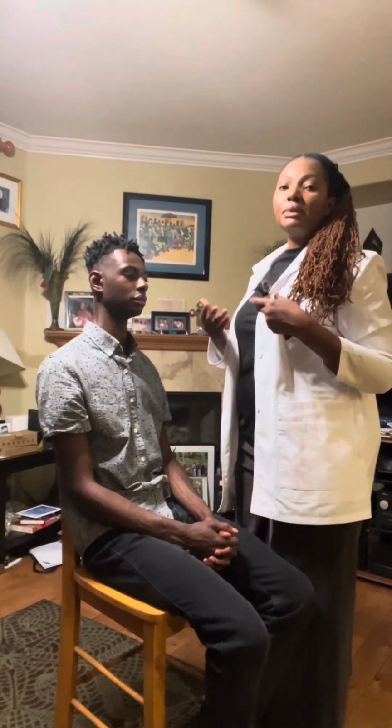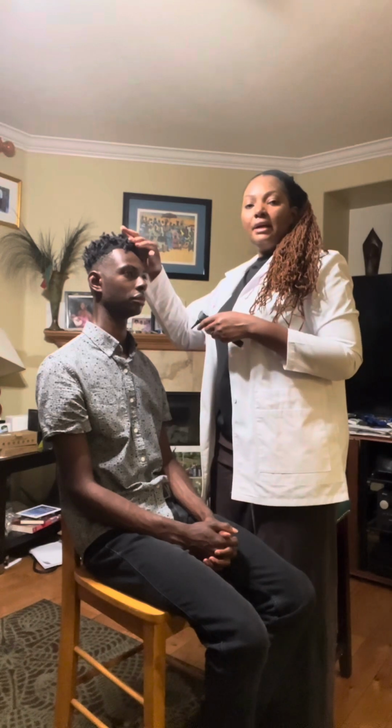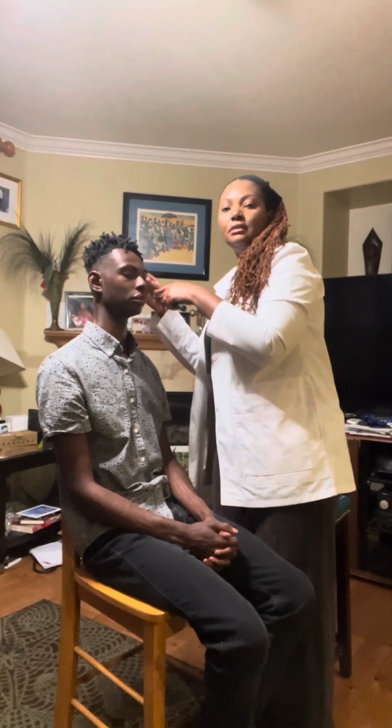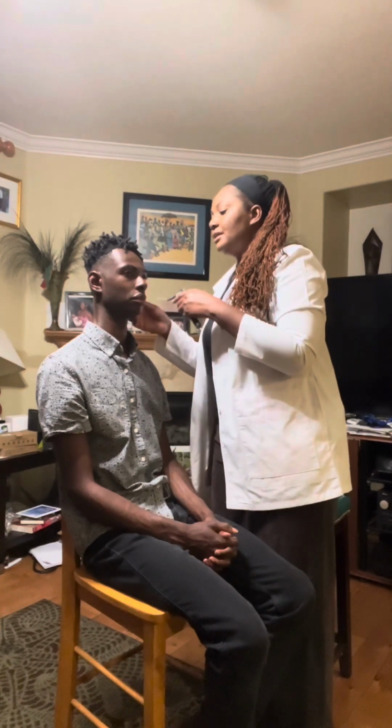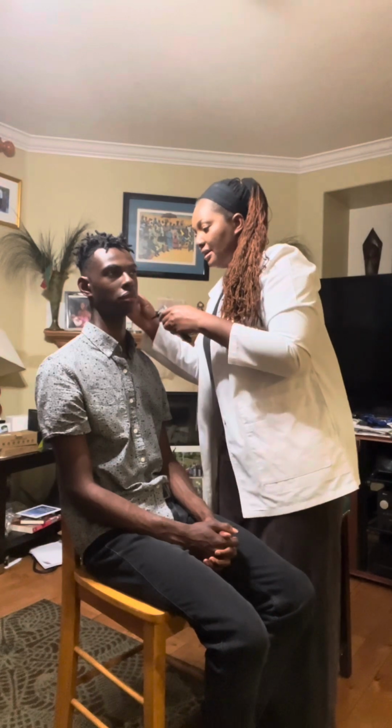With this, I have to be careful for safety reasons. So I have to support the patient's head with my hand so that the patient will not get hurt. Okay, so I am going to look into the patient's right ear.